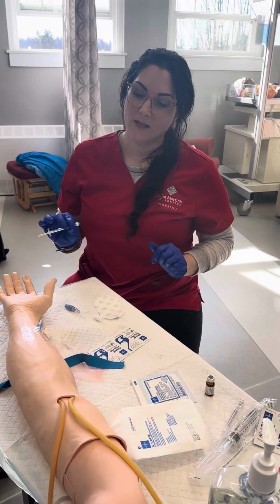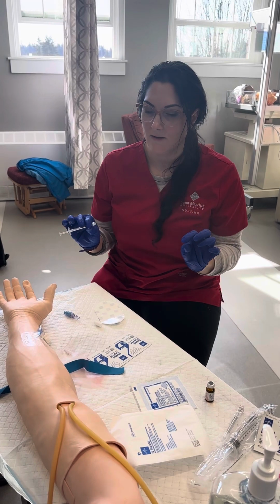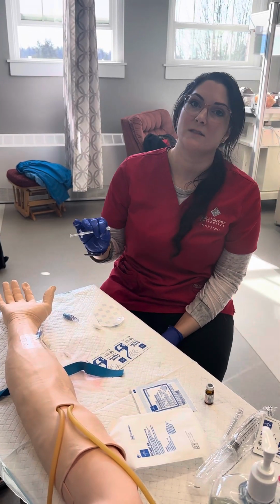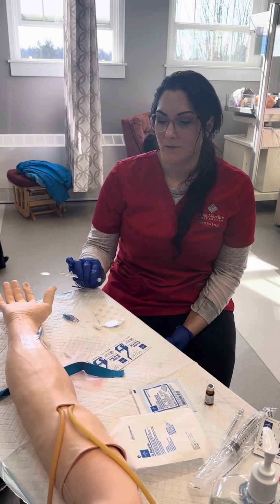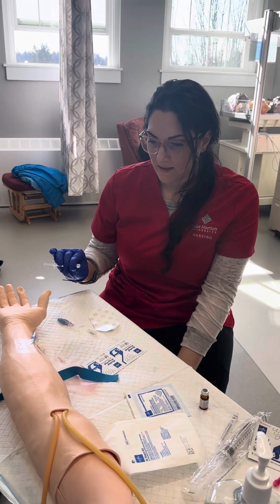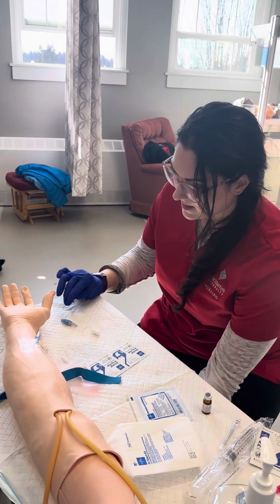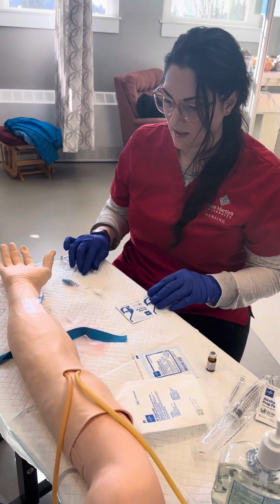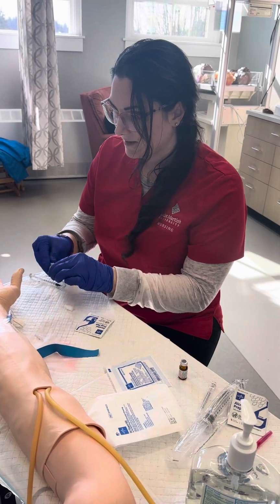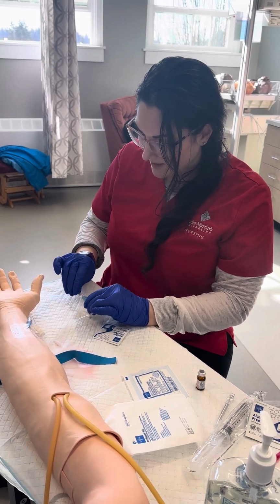All right, before giving the medication, I'm going to do my last checks. I have the right patient, Scott Mingus. I have the right dose, which is 0.3 milliliters of morphine, which I'm going to be administering at 0.1 milliliters per minute. The right route, IV site, the right time, which is now, and the right reason, because he's in pain, which he states is like 7 out of 10. So I'm going to go ahead and administer the medication. I don't remember if I cleaned that, but I'm going to clean this again just for fun. Okay, I'm going to go ahead and put it in.